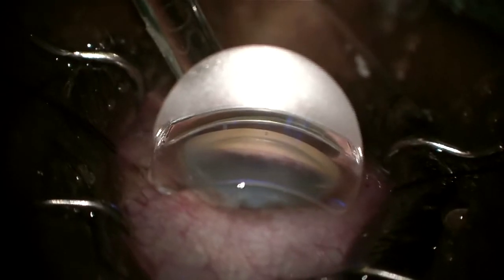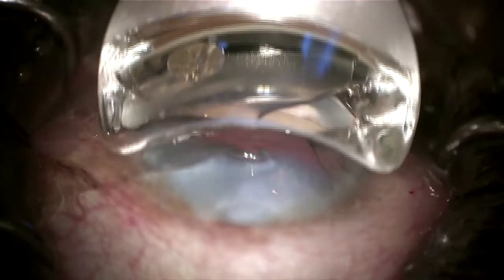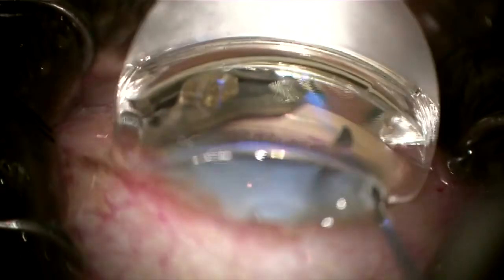Hey everybody, Dr. Paul Singh here describing a case where we're combining an omni-viscodilation procedure with Hydrus microstent implantation along with cataract surgery. Making sure of a good view, nice focus on the trabecular meshwork and other angle structures — probably the most important part of any mixed procedure.